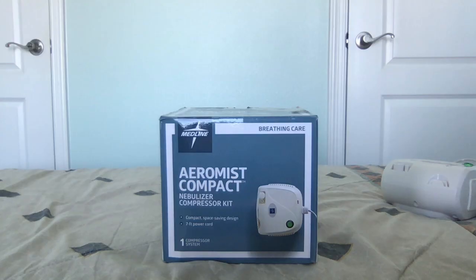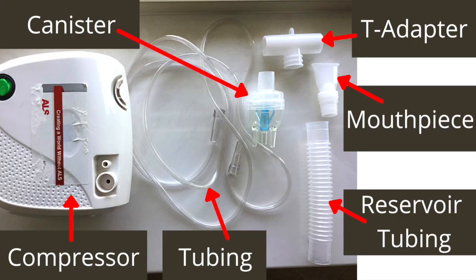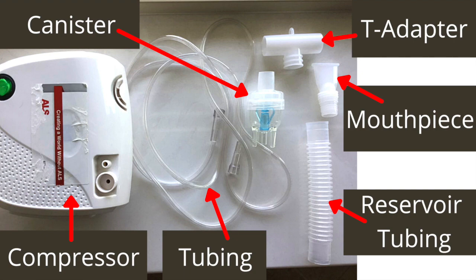When you receive a nebulizer, it will most likely arrive in a box with several different parts: a compressor, nebulizer canister, plastic tubing, a mouthpiece, a T-adapter, and a straight piece of plastic tubing called reservoir tubing.